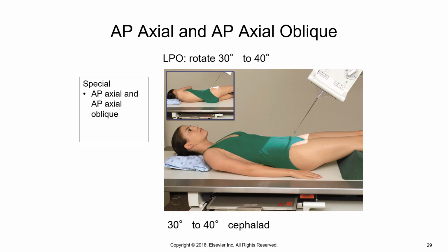With doing that, there are 4 different positions that will achieve straightening out the sigmoid colon. But you only have to perform one of these images, okay? So the 4 there are to choose from, this lists 2.